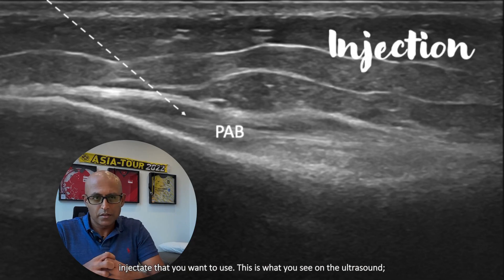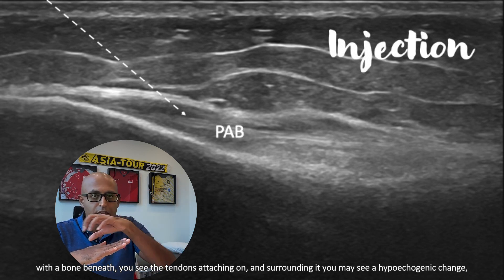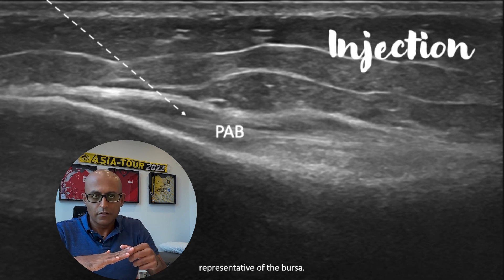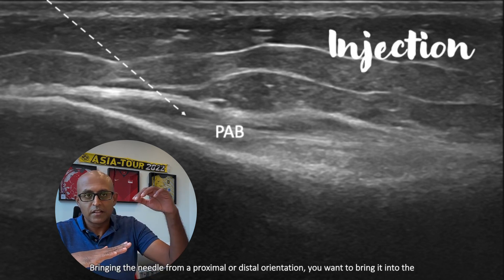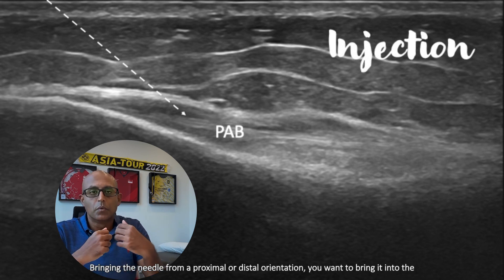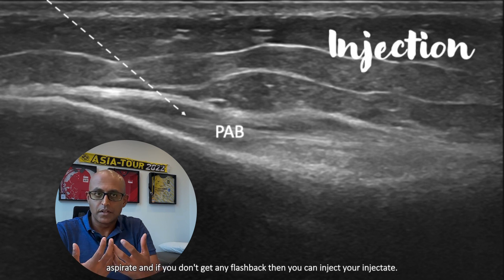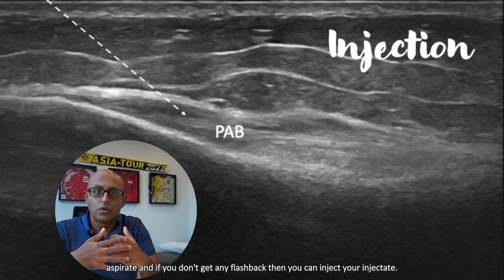And this is what you will see on the ultrasound. With the bone beneath, you'll see the tendons attaching on, and surrounding it you may see a hypoechogenic change representative of the Bursa. Bringing the needle from a proximal or distal orientation, you want to bring it into the hypoechogenic change, aspirate, and if you don't get any flashback, then you can inject your injectate.